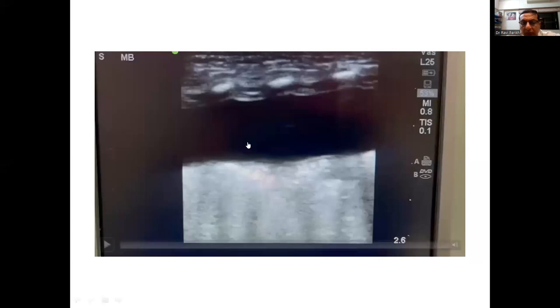It's a very nice case, ma'am. Then what it indicates is that this profile is not because there's a primary pathology with the lung, it's because you have compressive atelectasis. Yeah, very nice case. And again, this is the ideal view which we're not supposed to take such views, right? No, ma'am. So the one which you showed in the axillary lower area, where we can see the diaphragm and the liver and the effusion, if you go lower down, your transverse in the midline here, no, you're longitudinal because you have multiple rib spaces with a batwing sign.